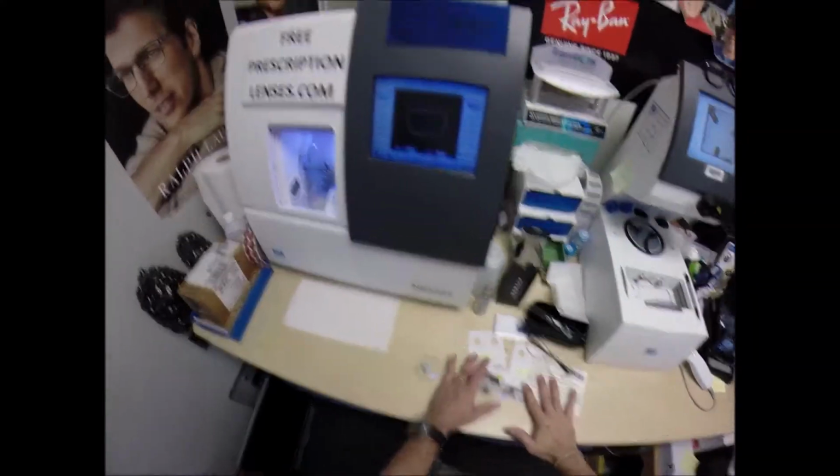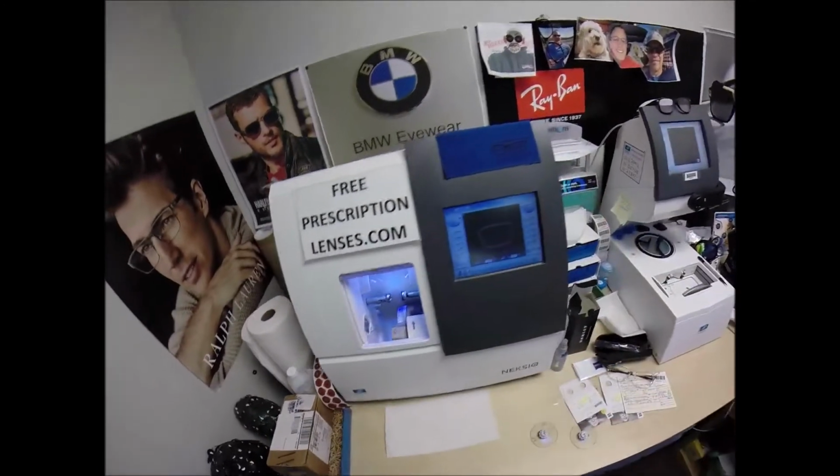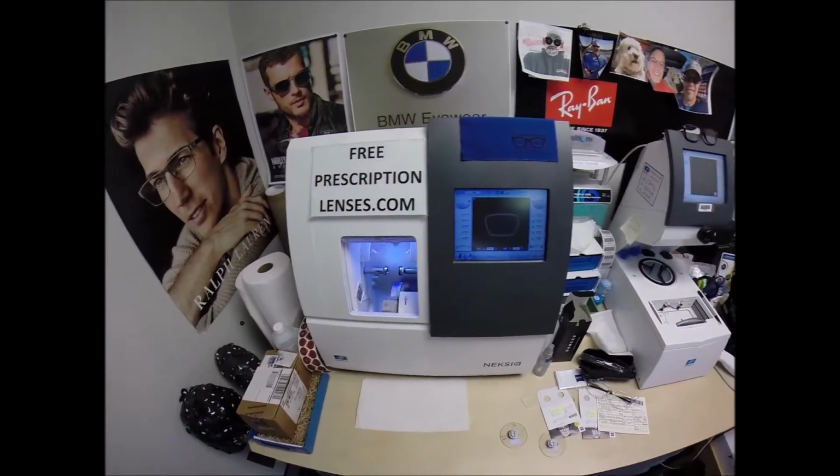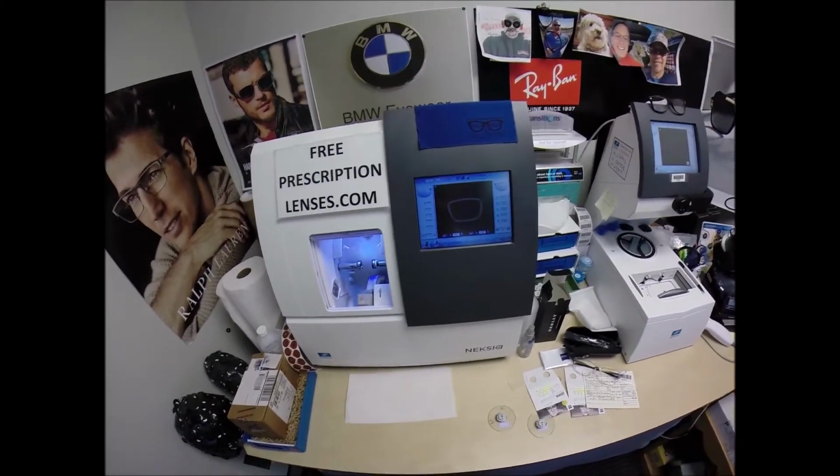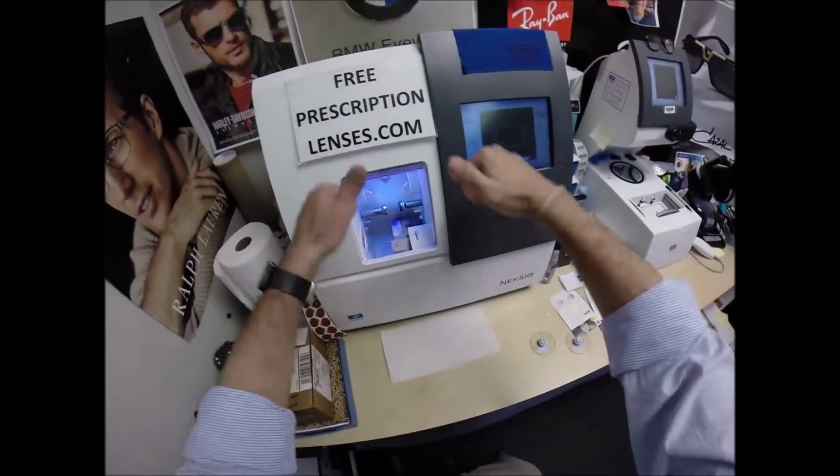Now we can come down here. This is the edger. This is what costs $40,000. It weighs 200 pounds. I recommend everyone go out and buy their own, put it on your kitchen counter, then you can cut your own lenses at home, and you won't need this guy who's prone to make mistakes with the two thumbs to do it for you.